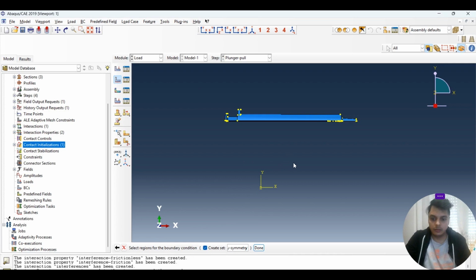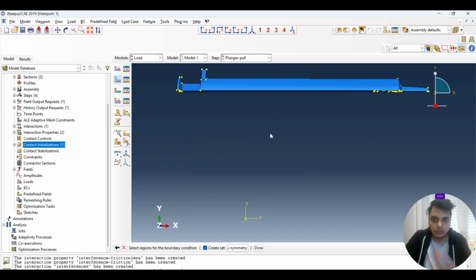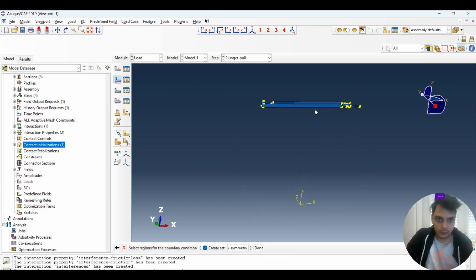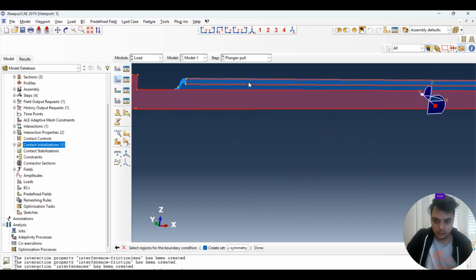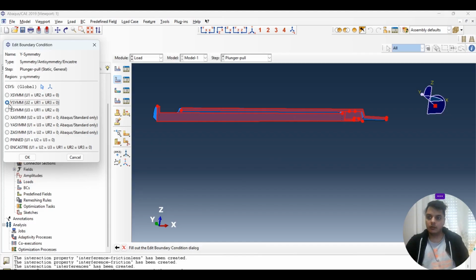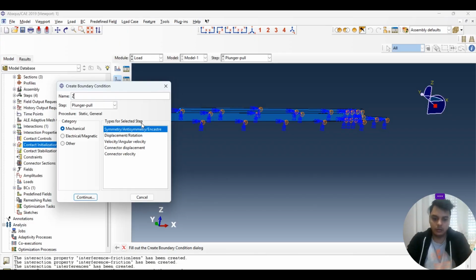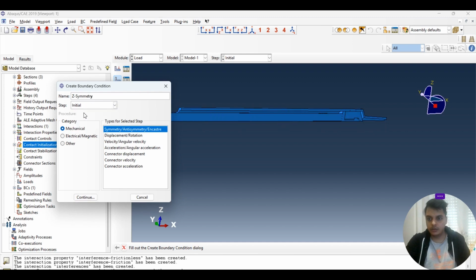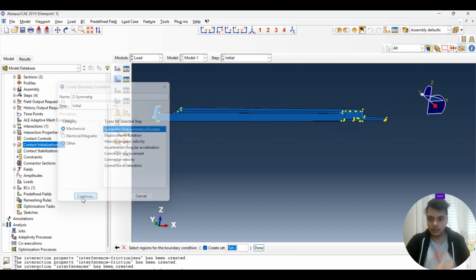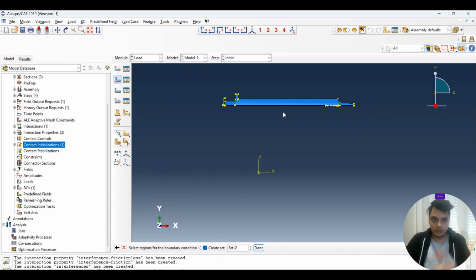Okay, so we have to select it. So what exactly is Y is, hold on. Okay, so we select here, we say done. We say it's a Y symmetry. That's done. We also have a Z symmetry, so we simply go and add the symmetry here. So again, going to be at the initial. That's the boundary condition.